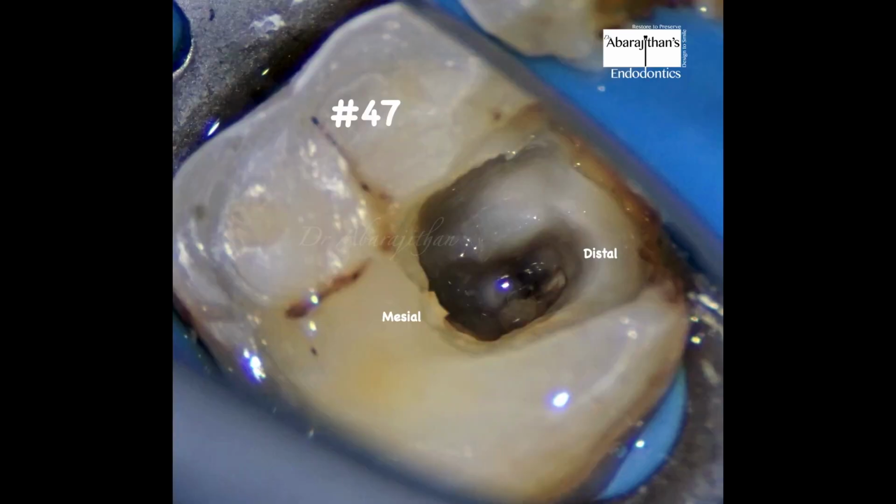And as you can see here, this is my access, and this much of access is good enough for me to complete this case. And you can see that there is a moment of caries that is left behind in the gingival seat. This is intentional because trying to remove the caries in the proximal box, almost near the gingival seat, can tear the rubber dam sheet and cause some problems during the workflow. So that is why we've intentionally left behind some caries over there.